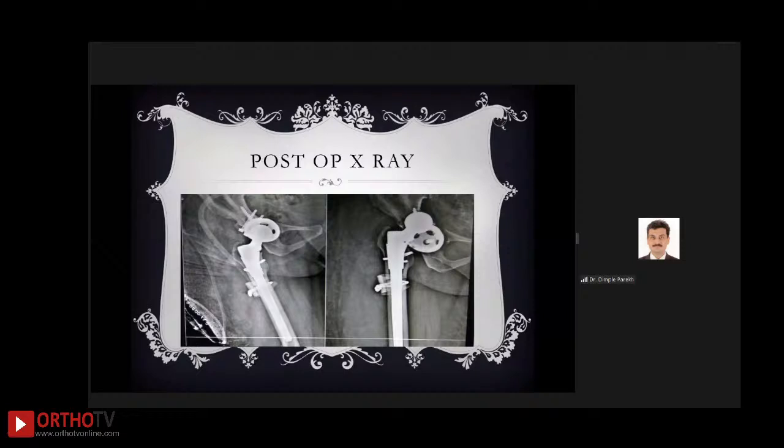In these cases, what we do is we just try to put the acetabular component in the best position, and then the femoral component is kept accordingly. SROM has an advantage that you can put the femoral component in whatever direction you want to keep. So that is the advantage of SROM.